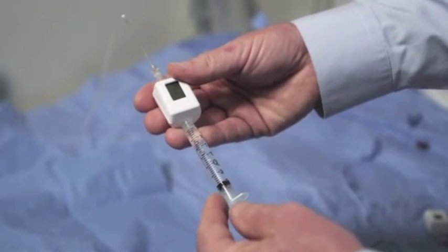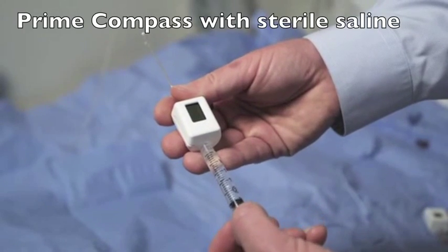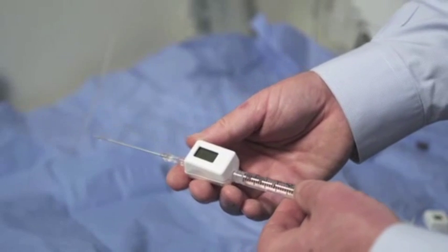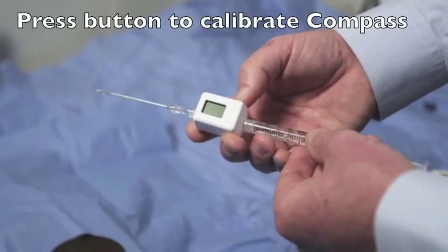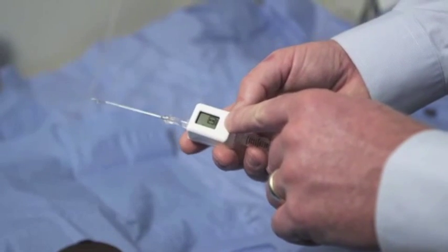Once the saline-filled syringe and needle are attached, prime the device with saline. Then, holding the device in the horizontal plane, depress the red button on the side and hold it until the device powers on and reads zero millimeters of mercury.